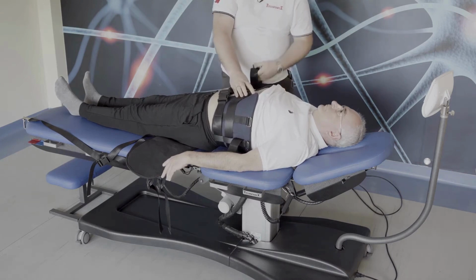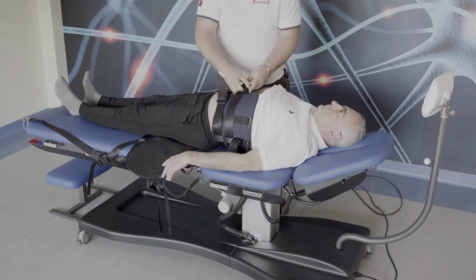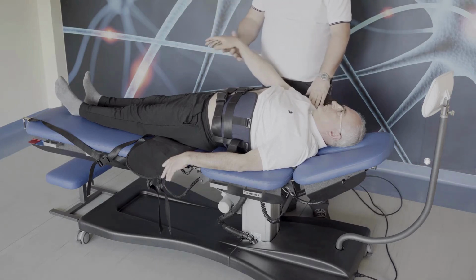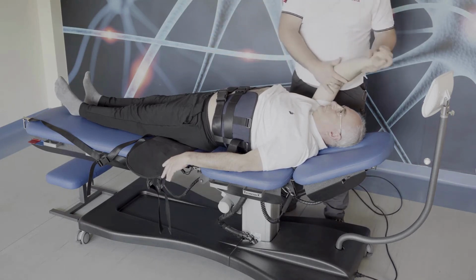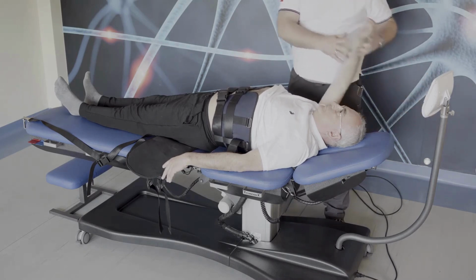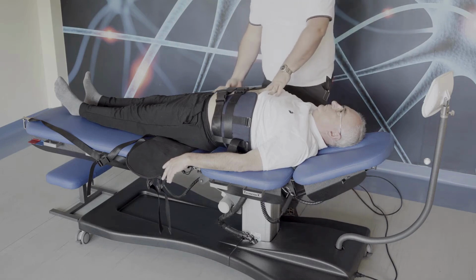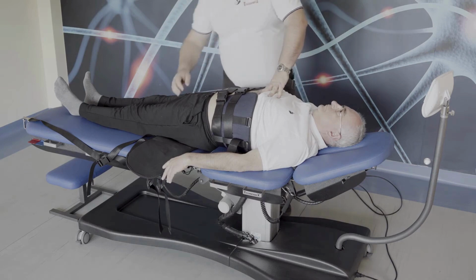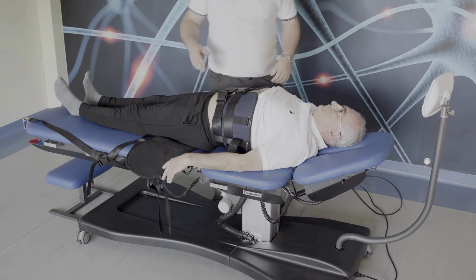What is very important is to make sure that the patient's hands are below the shoulders. They must not be over the head or like this, because the ribs are in a wrong position and it's easier to have an injury.